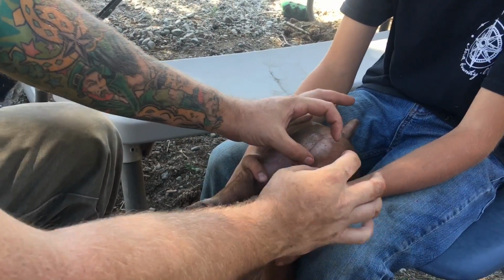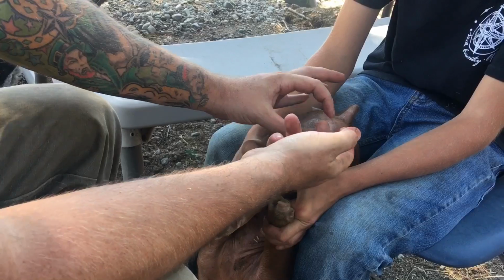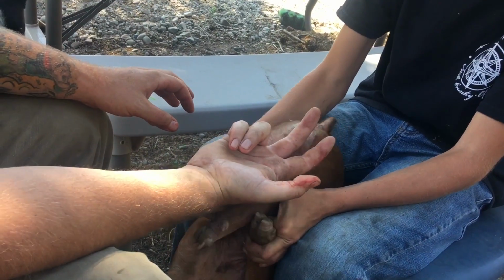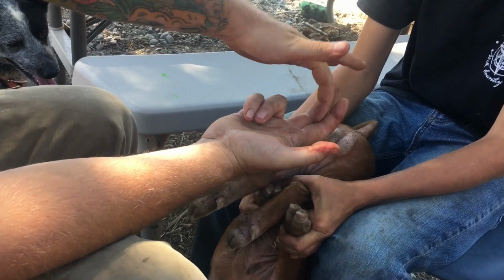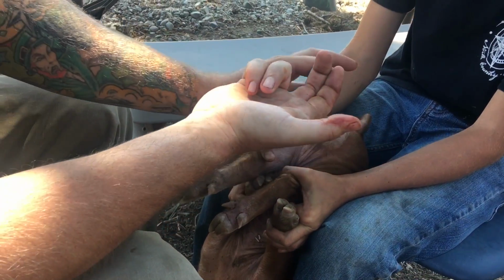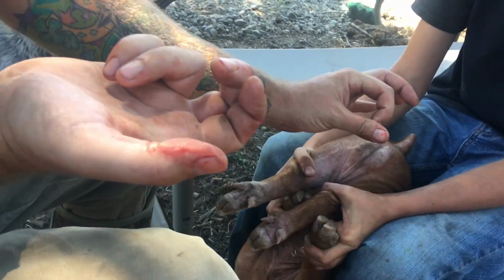Once we push the testicle out of the incision and you can get it out, what I like to do is reach through so that the testicle comes up in my fingers and I've got a good grab on it. From there, what we're doing is taking that testicle and just pulling it straight out.